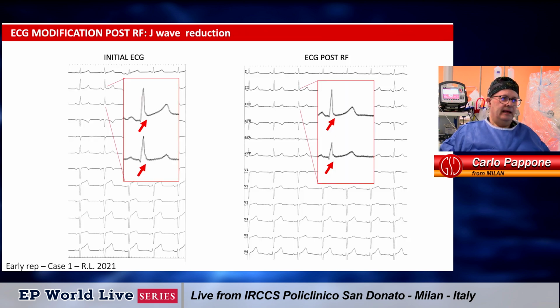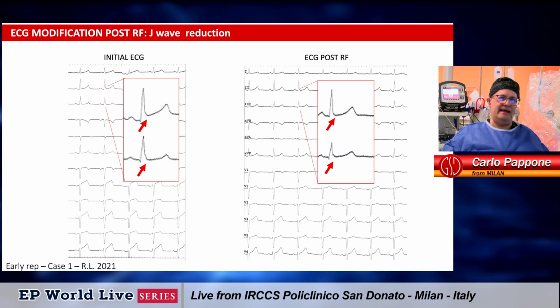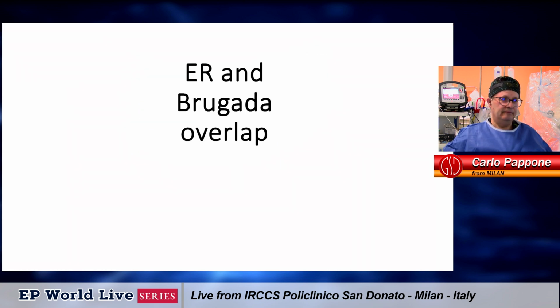Right? And interesting, after the ablation, we have the breakdown of the early repolarization. This is a very interesting behavior after the ablation, indicating that the early repolarization is strongly correspondent to the amount of fibrosis and is the phenotypic expression of the fibrosis, right?